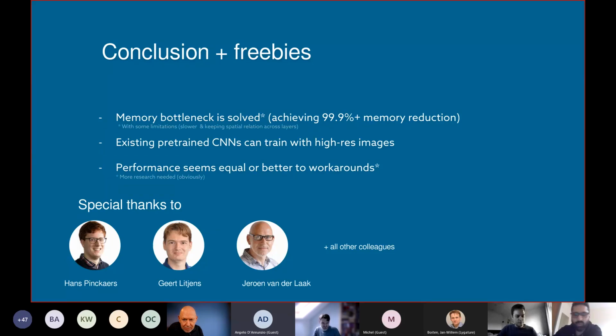Thank you very much. It's a very nice and innovative method, and I'm happy to hear this great talk. I just have one thing, maybe I have missed it. Usually we know that there are 2 problems. One is the memory bottleneck that you have solved very much, I hope. And second is the data. Deep learning requires a lot of data. When you reduce the patches and then try to get in the whole image, you are left with very few images. Like in one of the cases you showed, there were only 270 training set images. So how are those 270 images making the network able to learn?